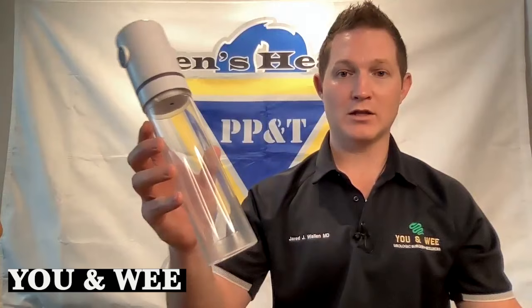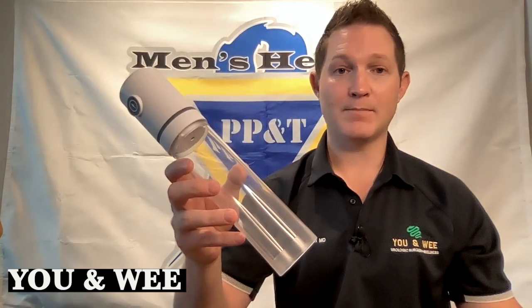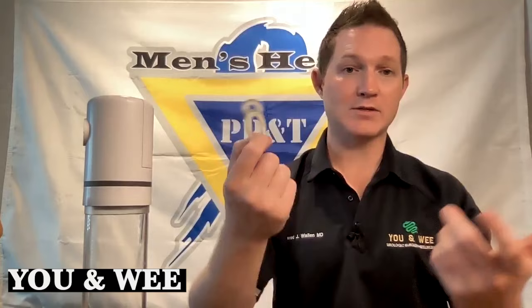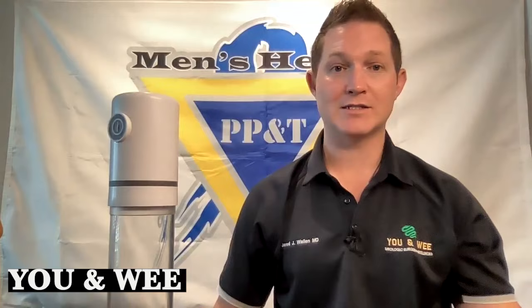This is a vacuum erection device. It's essentially an elongated cylinder that functions just like a vacuum — a negative pressure device which pulls blood into the cylinder to inflate the penis and recreate that inflow activity. There's also a little ring, called a penile ring or restriction band, which traps the blood. I also recommend a bottle of lubrication — to make it easier to slide the ring on and off, and to coat the edge of the cylinder so it gets a better seal on your skin.